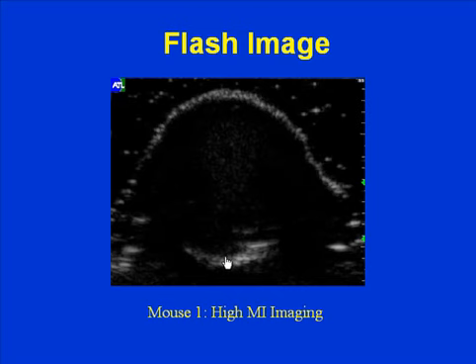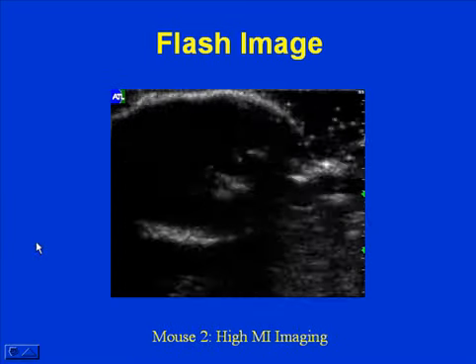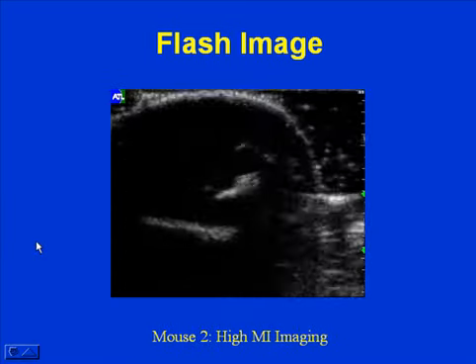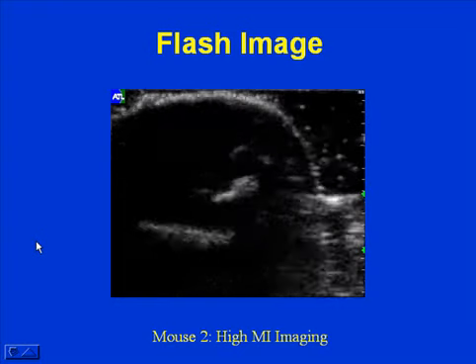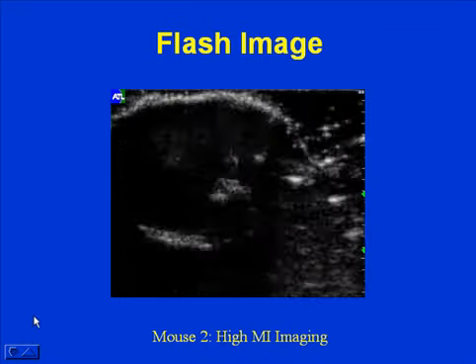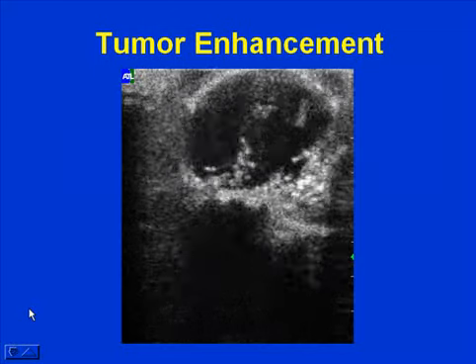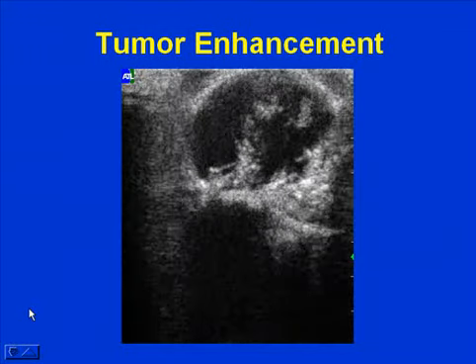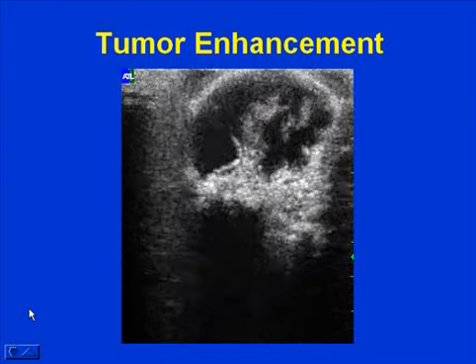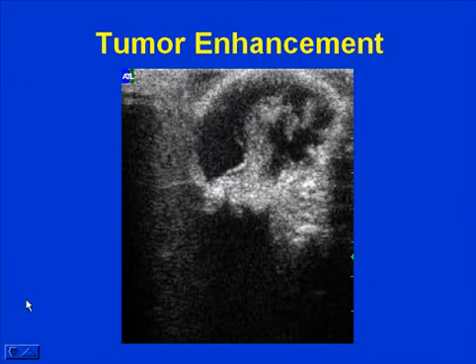Now, if we varied our flashing sequence, you can see in this tumor we could destroy the microbubbles and watch as they come in, or as in this case we do continuous visualization of the flow within the capillaries as the microbubbles perfuse this necrotic tumor.